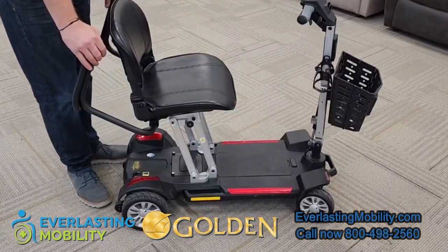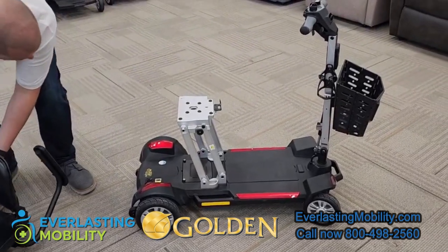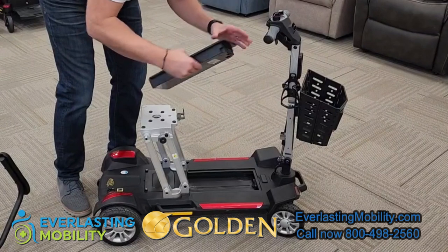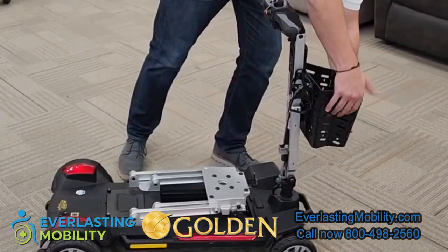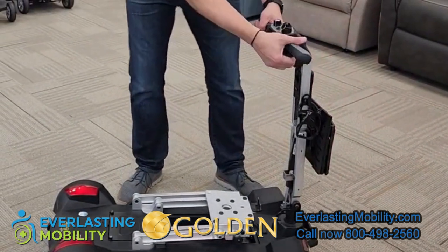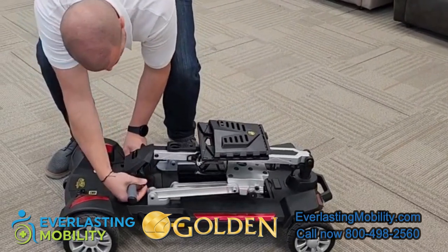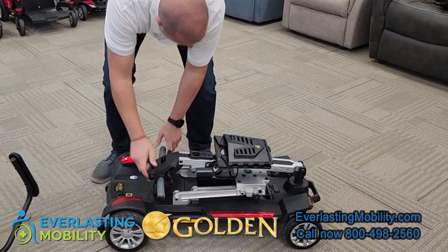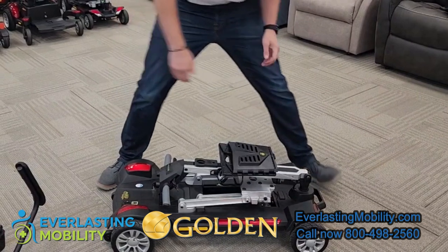To disassemble the scooter, first lift the handle underneath the front of the seat and the seat will pop right off. Next, press the button on the floorboard to release the battery. Then pull the two levers on the sides outward to release the seat post, which folds down flat on the floorboard. You can pop off or fold flat the front basket. Use the tiller lever to fold the tiller all the way down flat. This design was originally created to fit under the bed of a cruise ship cabin.